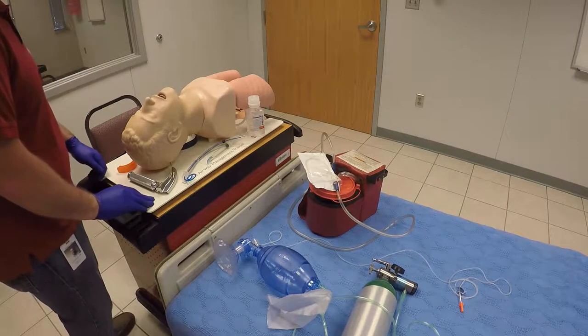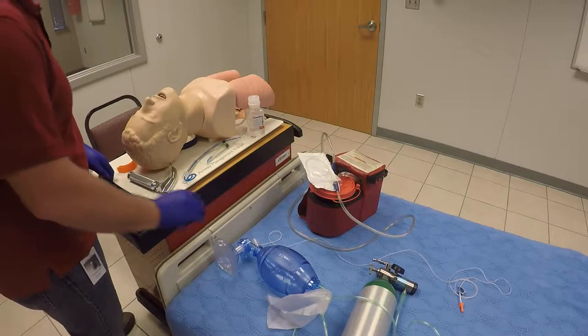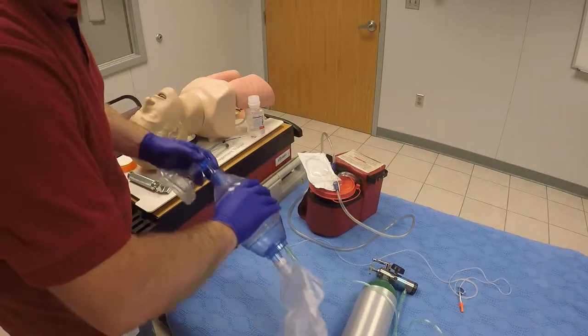This is direct oral tracheal intubation for the adult. First thing I want to do is check all my equipment. Make sure you have a BVM here with the mask and the reservoir. I can go ahead and attach it to high flow O2 there.